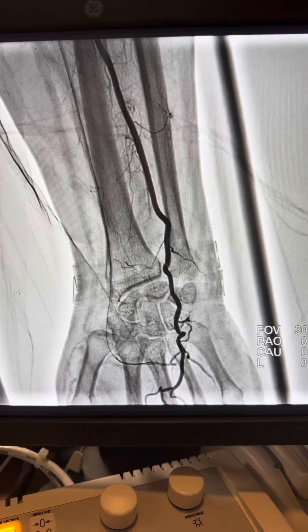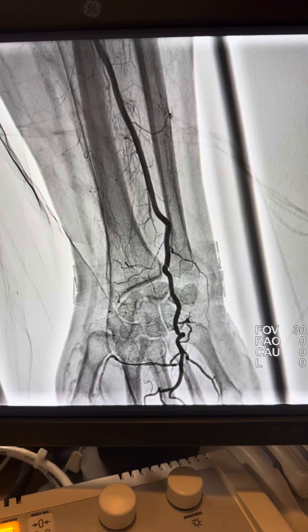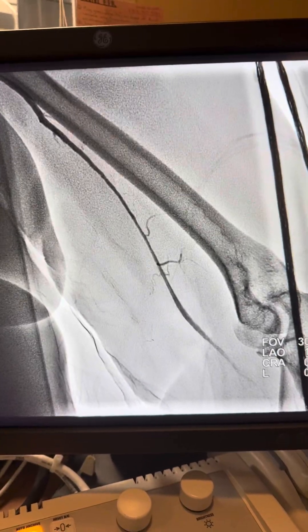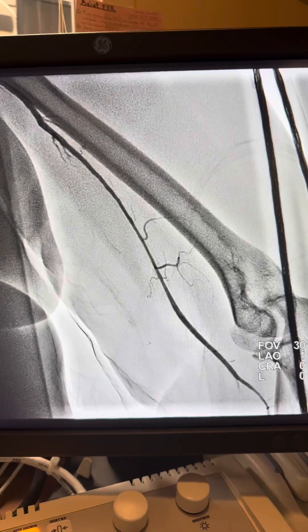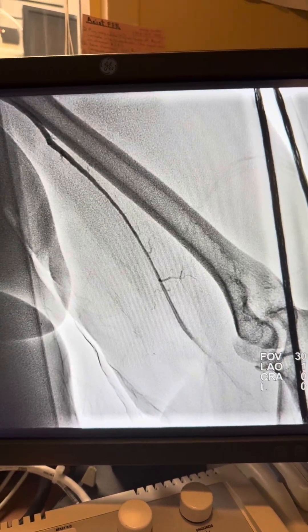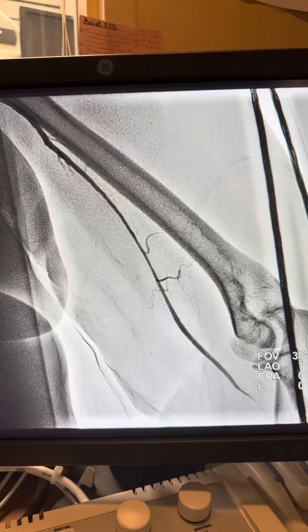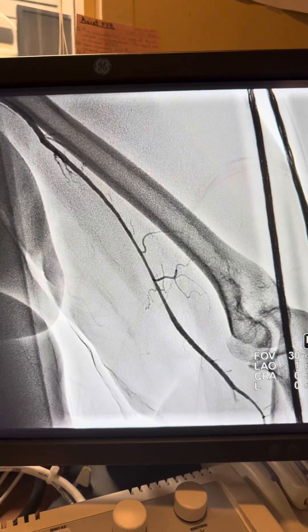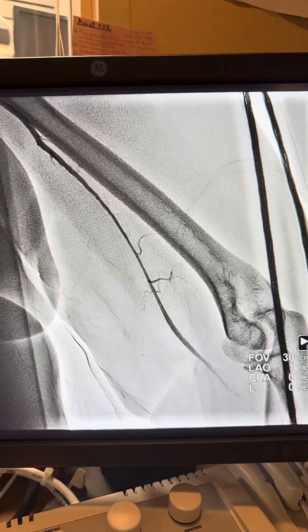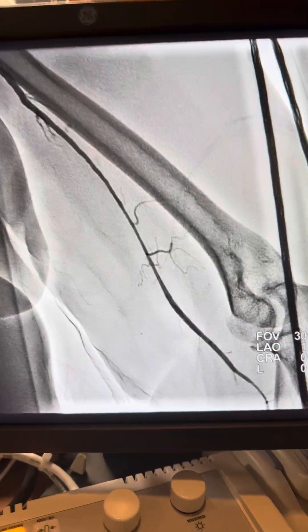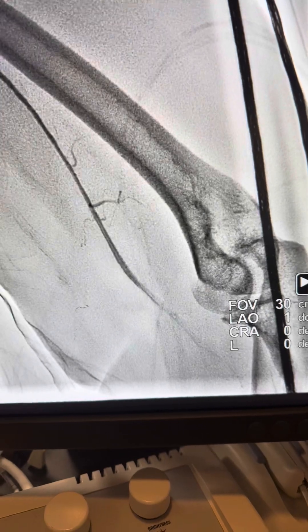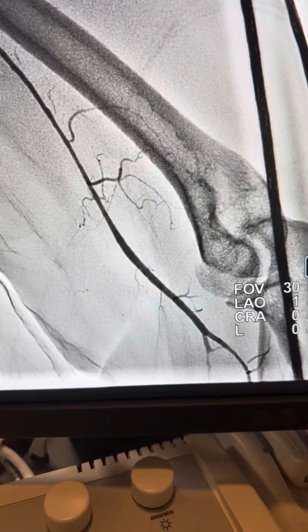We started the case from the femoral artery and advanced a GR guide into the axillary artery. Here you see injection showing severe spasm and some stenosis in the axillary artery, with no flow in the radial.